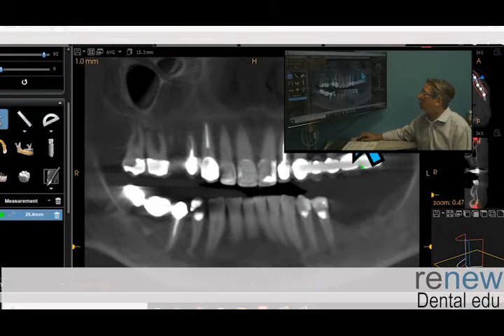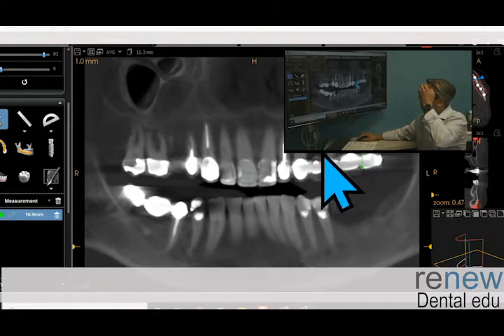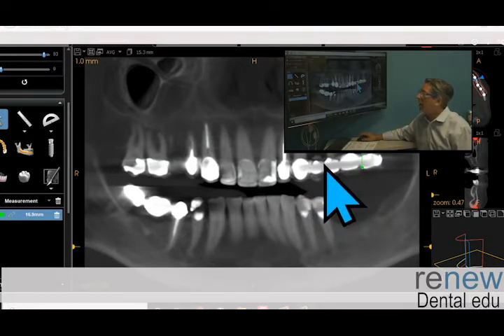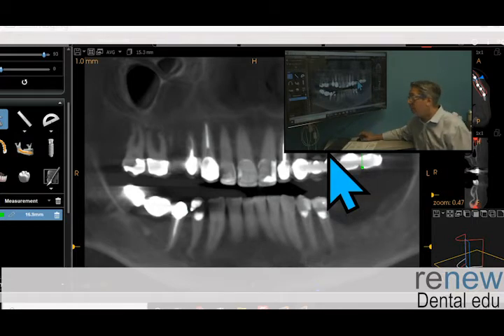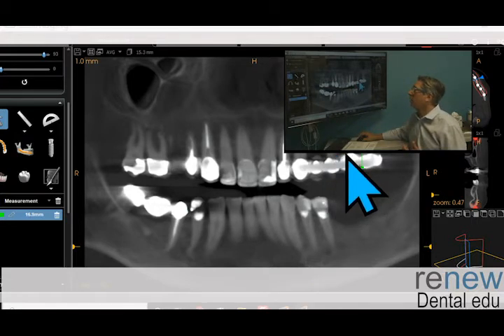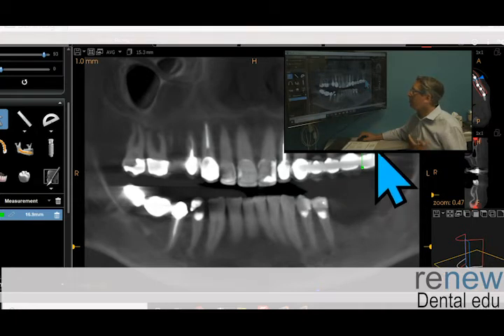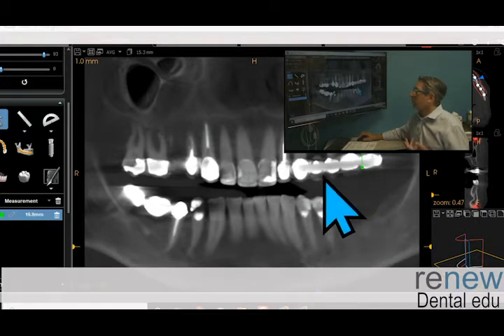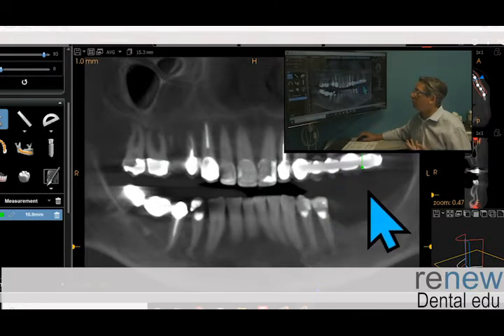And so this bridge that was cut out, she wants this back in. Regardless of an implant here, an implant here, she doesn't care about the hygiene as much as I tell her that now it becomes less hygienic and can put these implants into jeopardy. If we get them to be successful, she still doesn't care. She wants a tooth going off 2 implants here, so when she smiles, there's no gap. This tooth is still there. This tooth is still there. So that's fine as long as you don't have now a diving board coming off these 2 implants that you don't want to lose and sacrifice due to biomechanics. I don't think we're going to have a problem because there's nothing there to chew against.